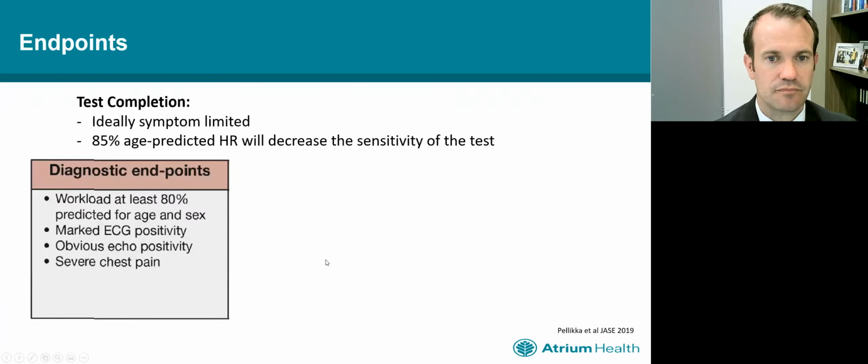For the endpoints, particularly for treadmill or exercise, ideally, this should be symptom limited. That is going to maximize our sensitivity and specificity of the test.